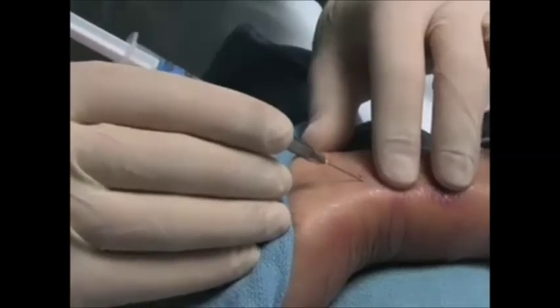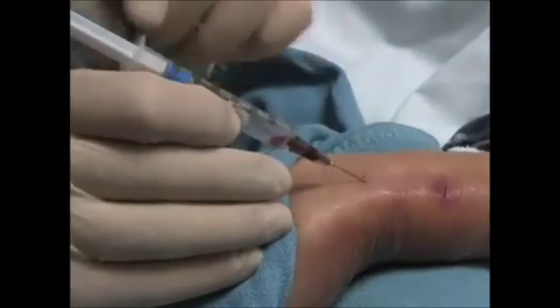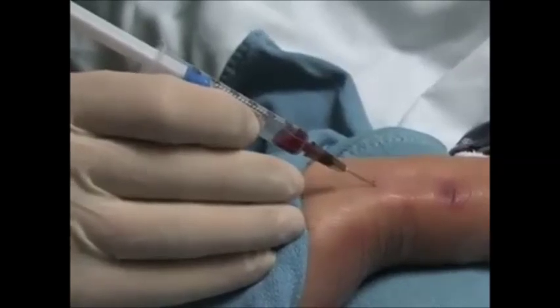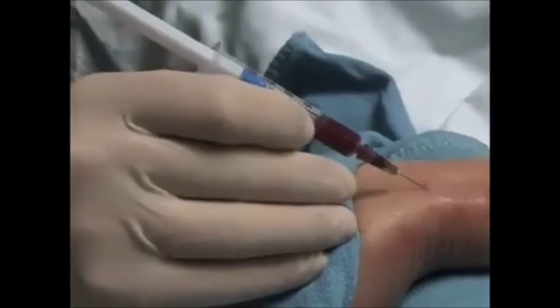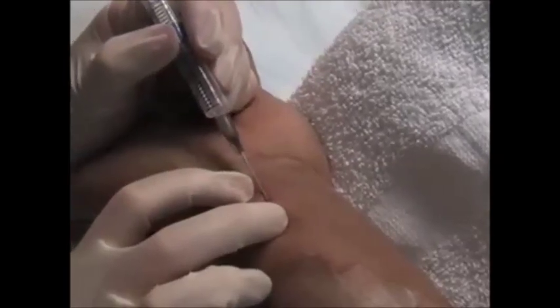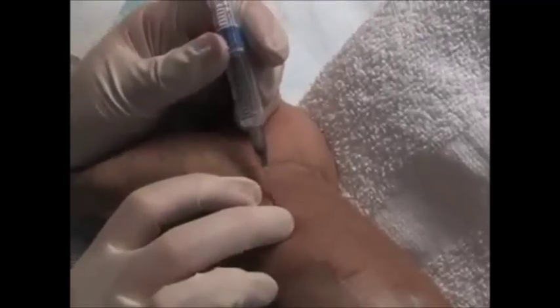Advance the needle slowly until the syringe easily and passively fills with bright red pulsating blood. Ideally, you should obtain at least 1 to 2 cc's of blood. If no blood is obtained, do not pull back on the plunger. Withdraw the needle slowly until it is just under the skin and reattempt the procedure.